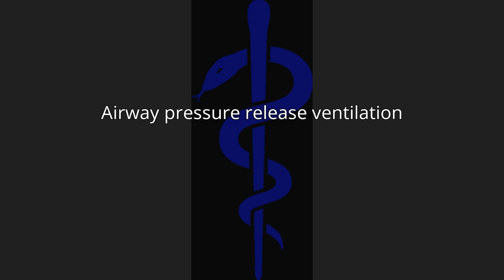Other manufacturers have followed with their own brand names: Bilevel, Duopap, Bivent. Although similar in modality, these terms describe how a mode is intended to inflate the lung rather than defining the characteristics of synchronization or the way spontaneous breathing efforts are supported. Intermittent mandatory ventilation has not always had the synchronized feature, so the division of modes was understood to be synchronized IMV versus IMV not synchronized. Since the American Association for Respiratory Care established a nomenclature of mechanical ventilation, the synchronized part of the title has been dropped and now there is only IMV.